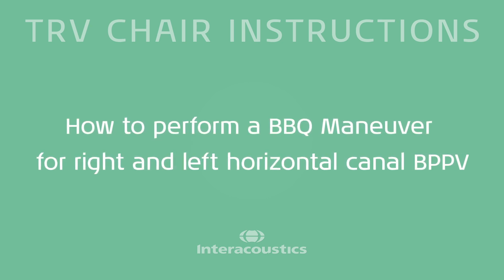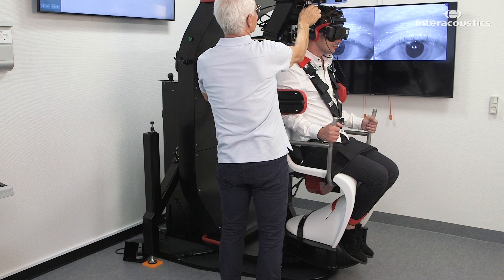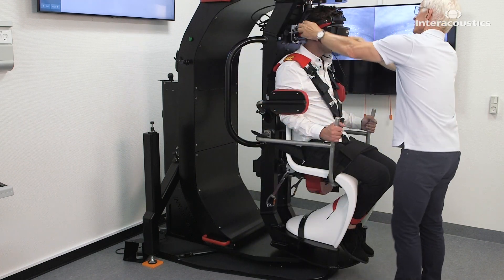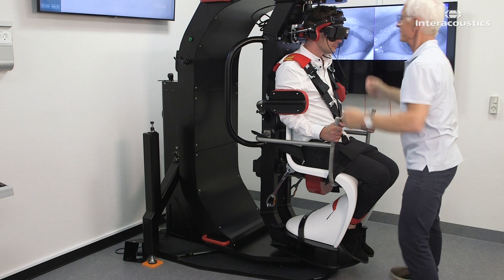This is how you perform a dynamic barbecue maneuver for right and left horizontal canal BPPV in the TRV chair. This maneuver is suitable to treat both cupulolithiasis and canalithiasis.